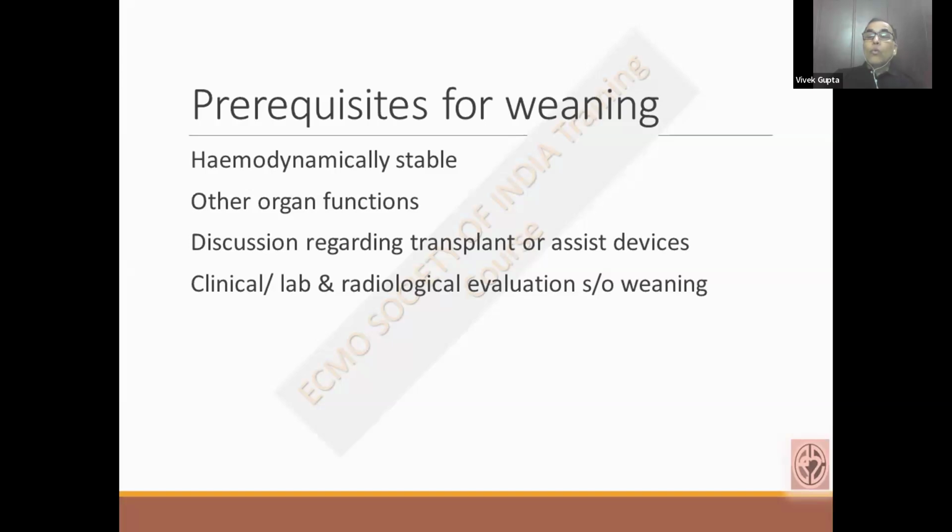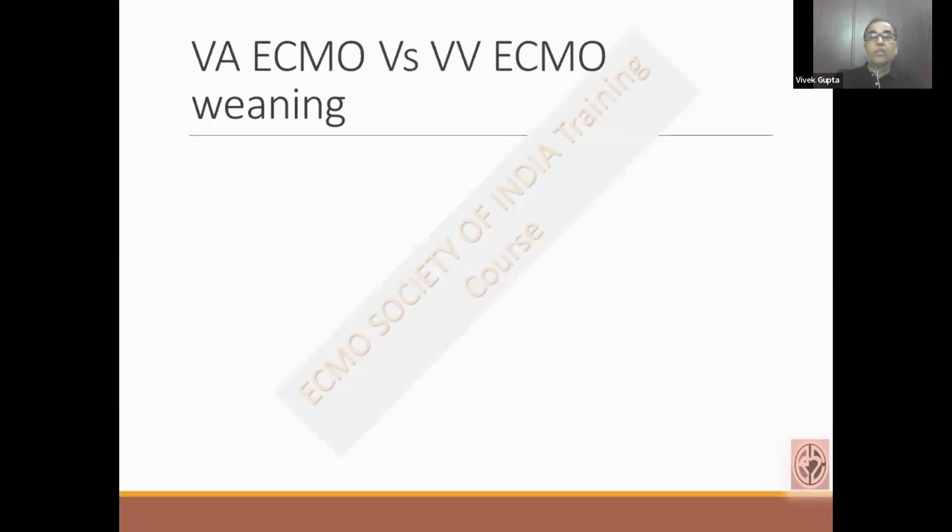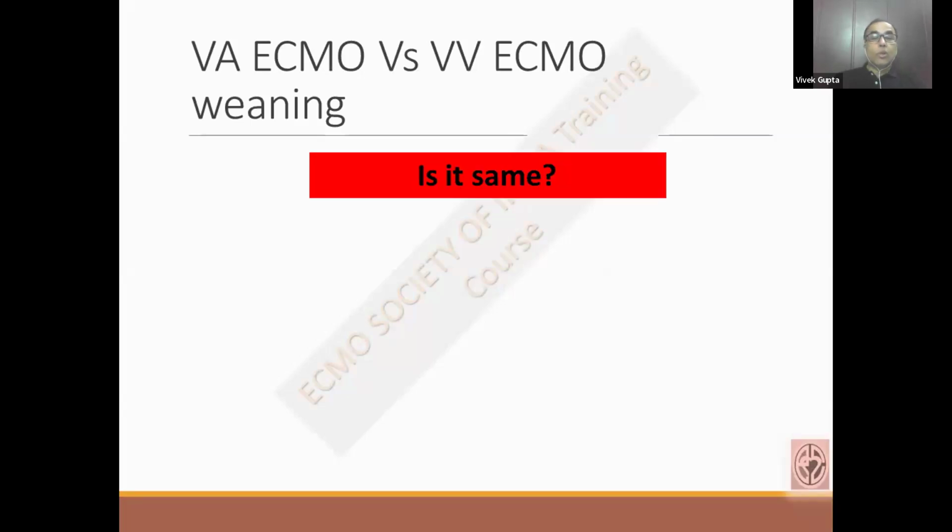Or we have decided about the transplant or assist devices, or the clinical, lab, and radiological evaluation has told us that the patient is recovering along with hemodynamic stability and other organ function. That means this patient can be weaned from ECMO.